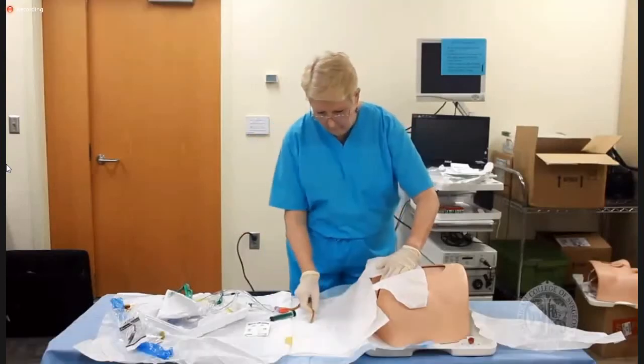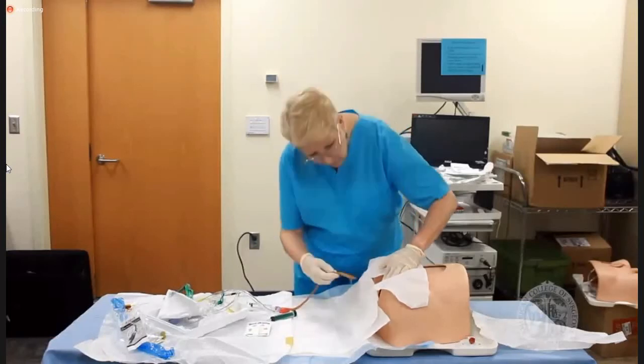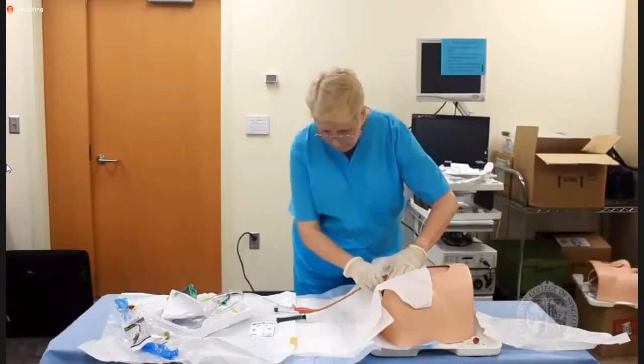To cleanse the left, followed by the right side of the periurethral area. Continue to spread the labia with your unsterile non-dominant hand. Grasp the pre-lubricated catheter and insert the tip into the meatus.